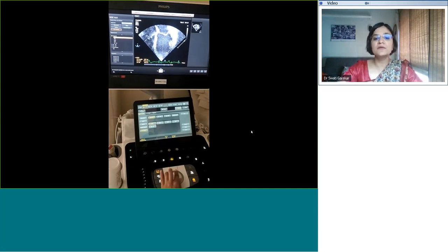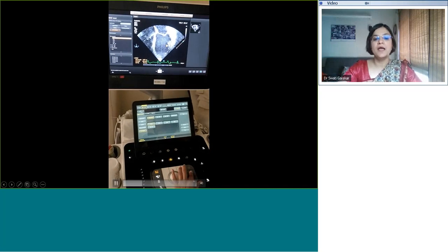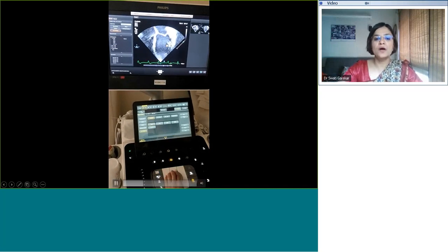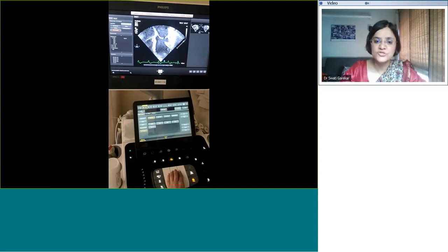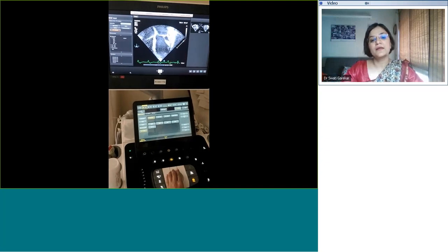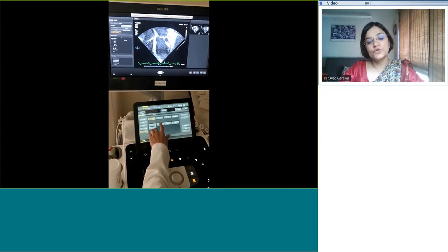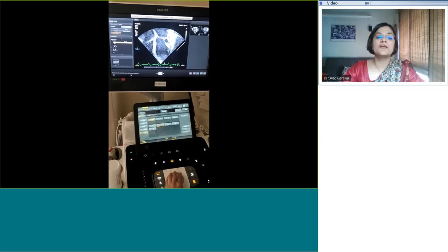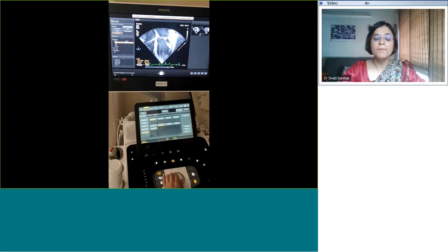Make sure you include the mitral papillary muscles within the cavity of the LV, and again scroll and get your smallest volume, and that's your systolic frame. So repeat everything, all the steps there. Then go ahead and get a 2-chamber view and repeat that, and it will give you a biplane ejection fraction. One very, very important number that it also gives out is the end diastolic volume by biplane.